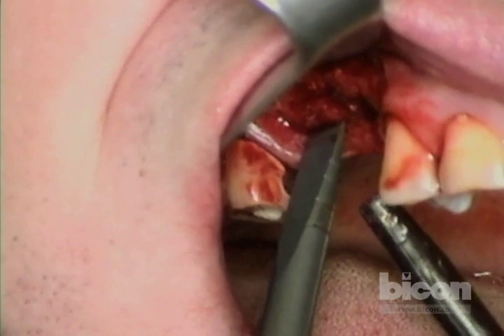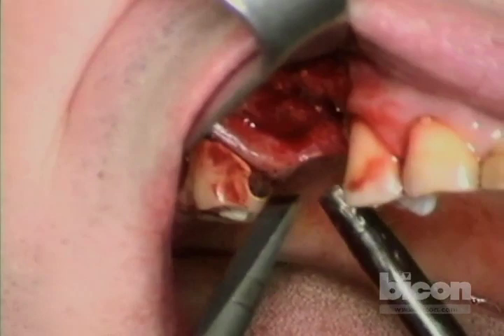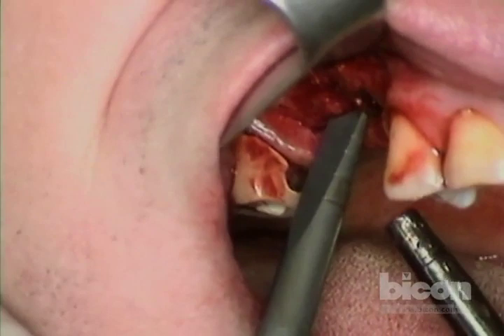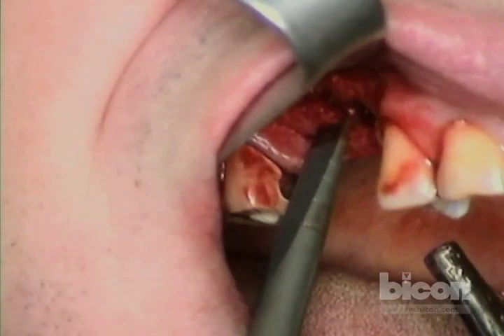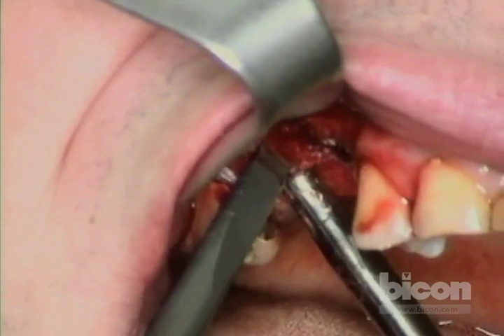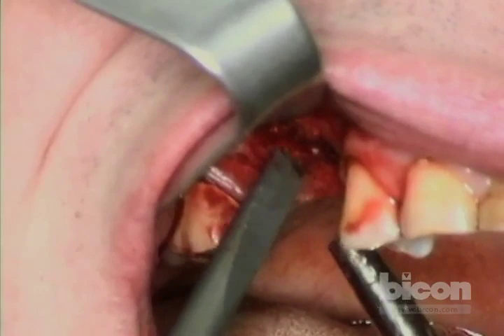The main reason this technique works is because of the plateau design of the Bicon implant, where a blood clot and bone graft will heal just as fast and give us predictable osseointegration as would another implant type in fully healed mature bone. That's the reason we're able to use this kind of technique.